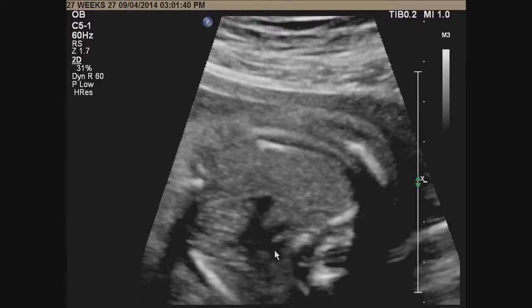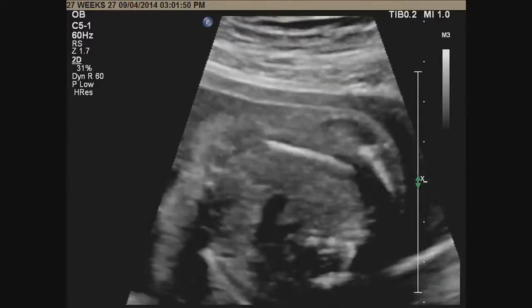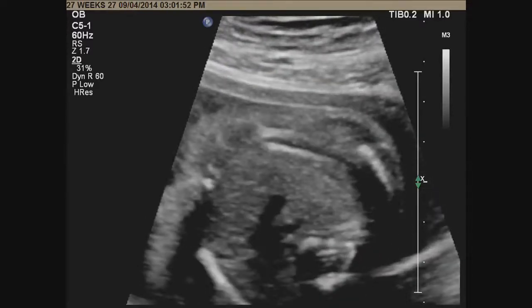Okay? So that is a plane that is normal. You're very high up in the chest. And be careful, this is called the transverse arch view. And then if you slide slightly above that, you'll see what we call the brachiocephalic vein.